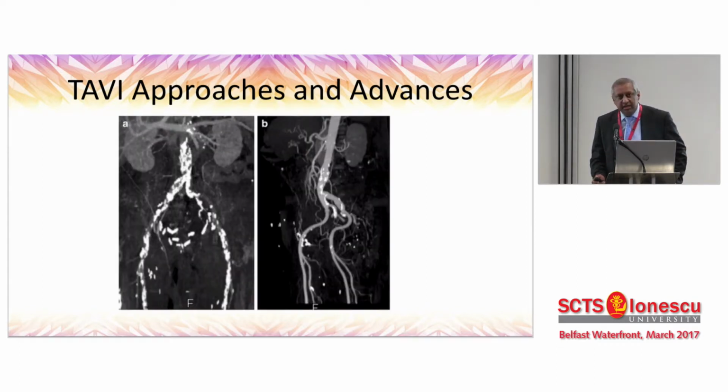The more tortuous the iliacs are, the more tricky it is to get your TAVI devices up the aorta. And obviously there are tips and tricks using buddy wires and more stiff wires to try to straighten these tortuous vessels. But overall, the picture you see on your left is something you definitely should avoid, and probably refer to a friendly cardiac surgeon to help you with an access elsewhere in the body.